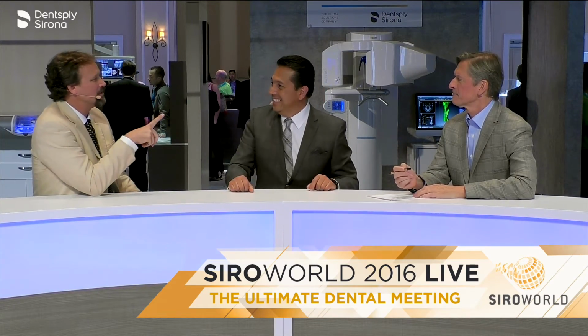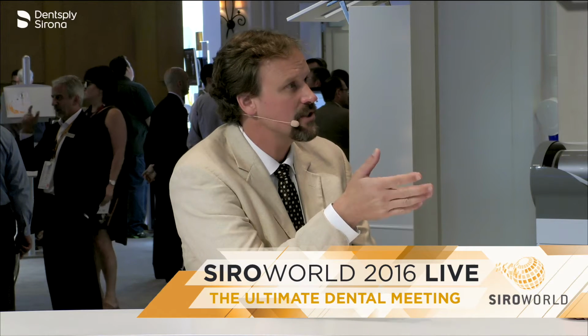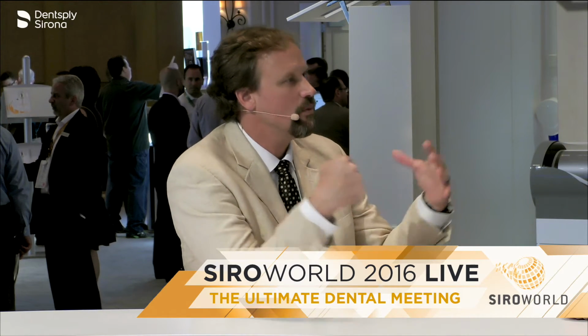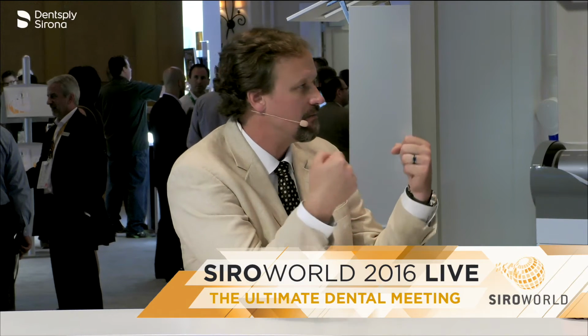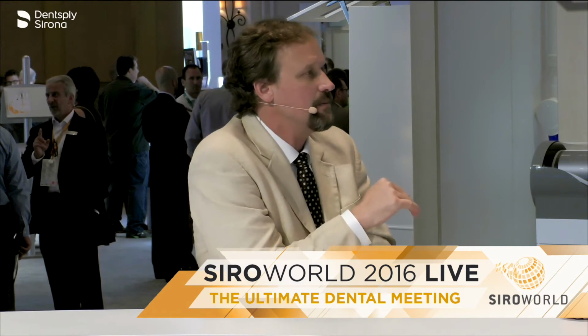So implants don't do that. Implants are fused to the bone. They have no give whatsoever. And so what's potential for the IS material is that it could be the shock absorber for a system that we're hammering into, biting on ice and food and things like that, whereas implants don't have the ability to do that currently. So that's another way this material could totally be used.